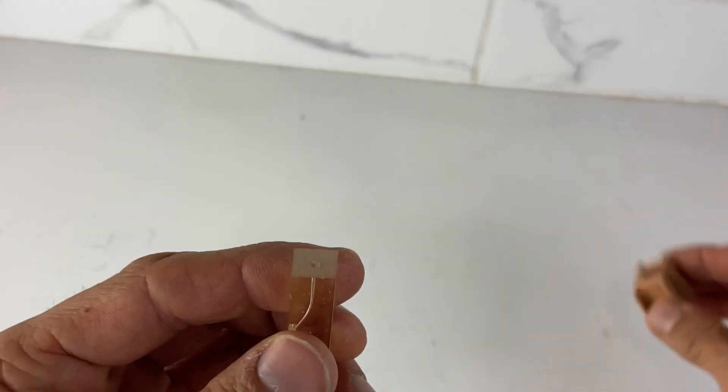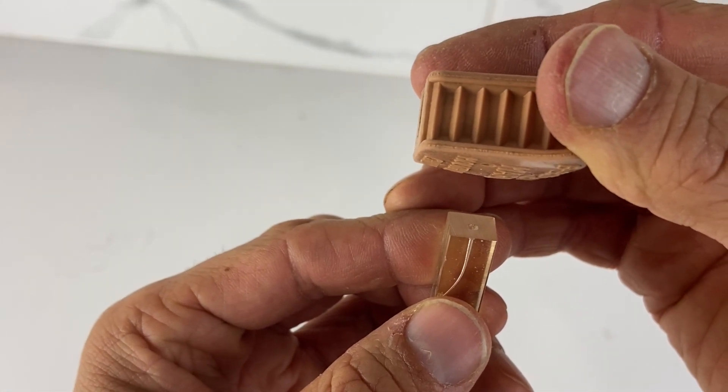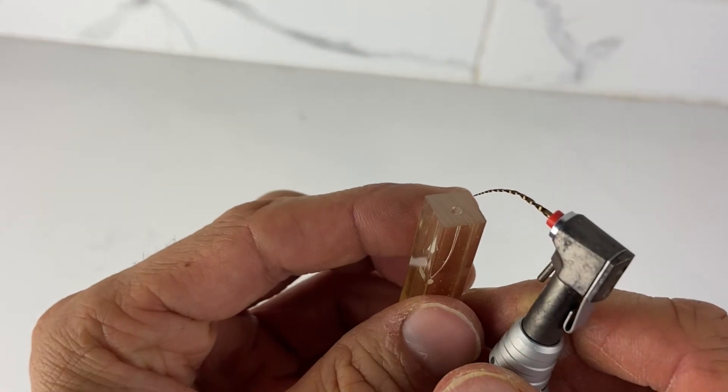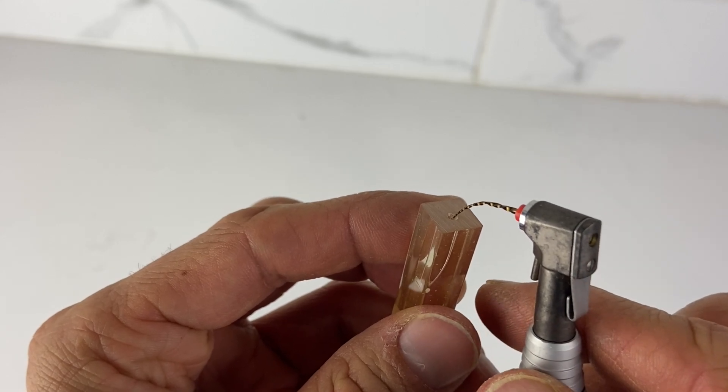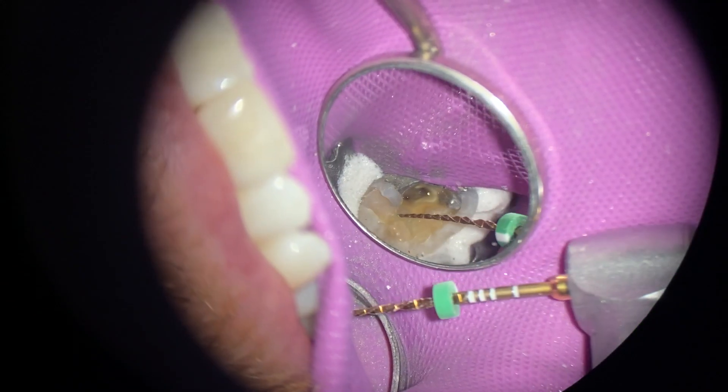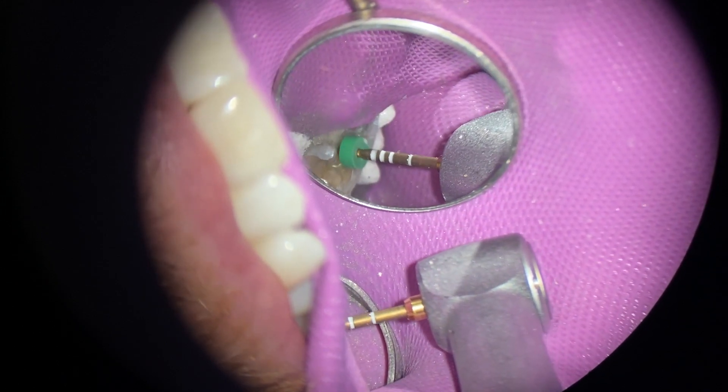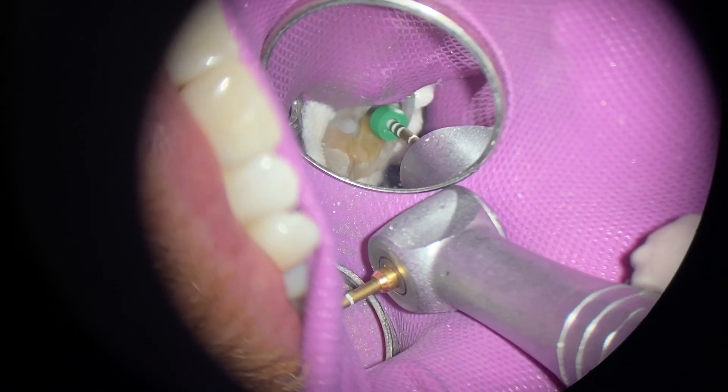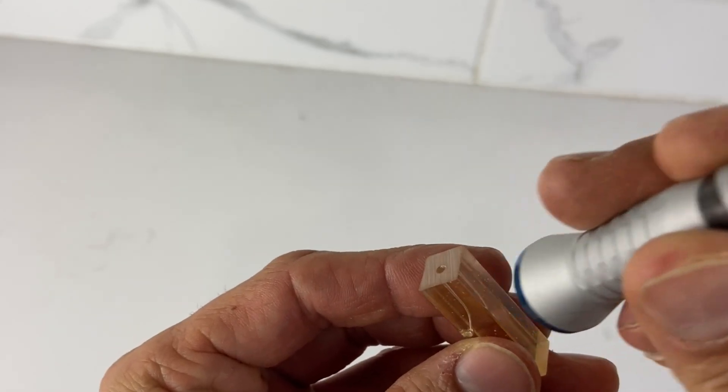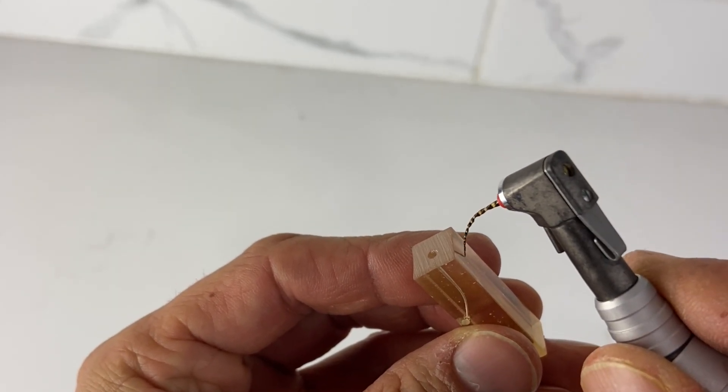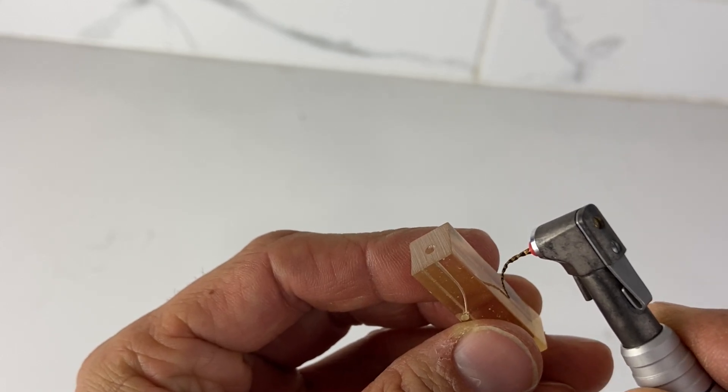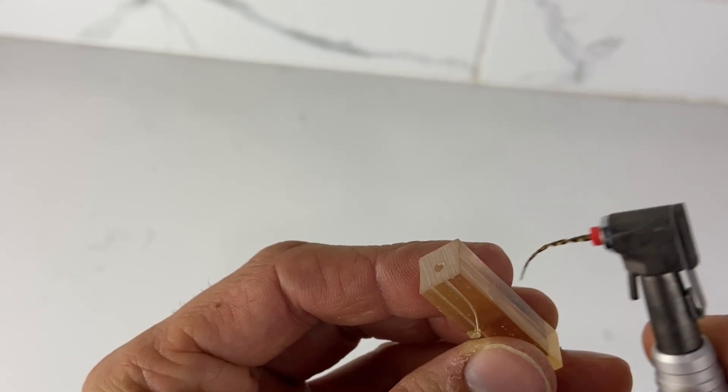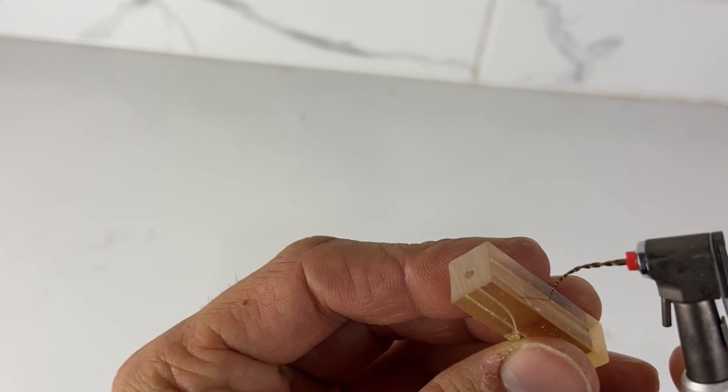This is a routine thing to get into MB2 to MB1. And imagine again, the opposing, the rubber dam is only like that high. So you're able to sneak it in. This might be a little bit too much, you're getting a little excited. Be able to sneak it in and then somehow bring your mirror in and then look to see to get it in that place. Having straight line access makes a huge difference too, especially almost not too wide of an access, but it allows you to slide this down.